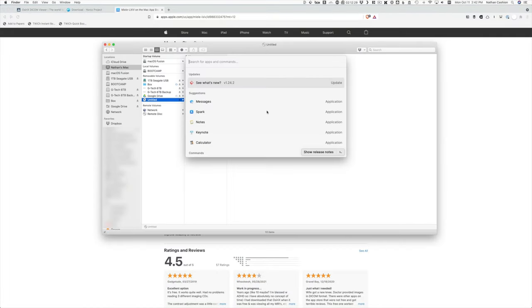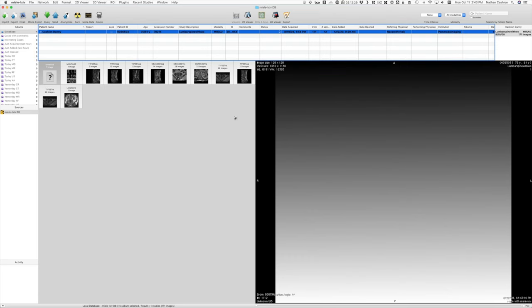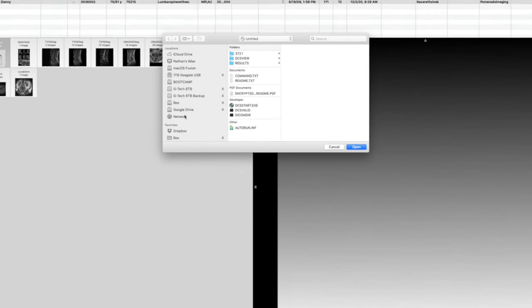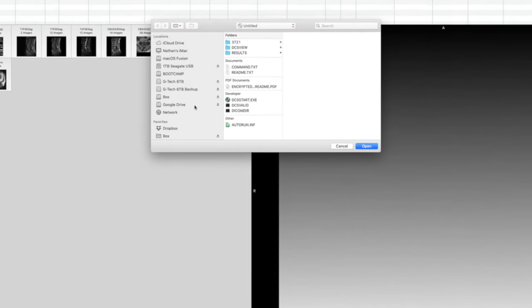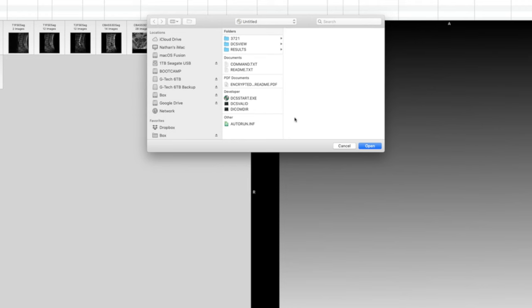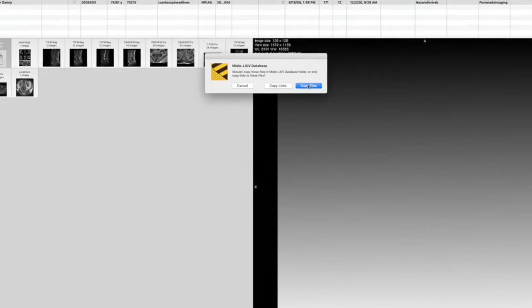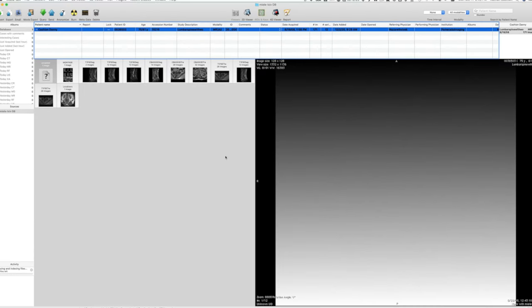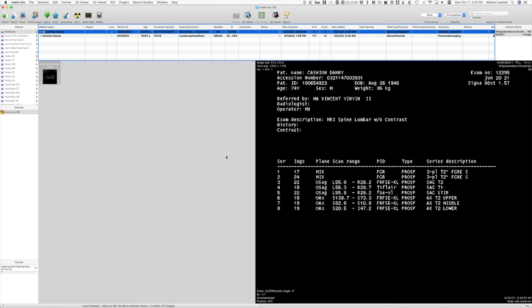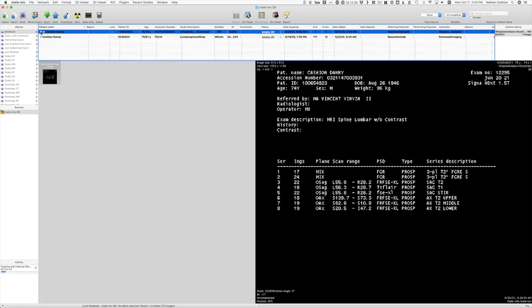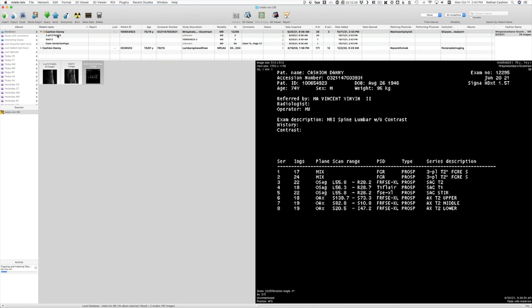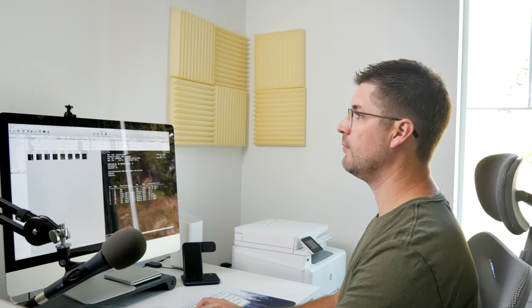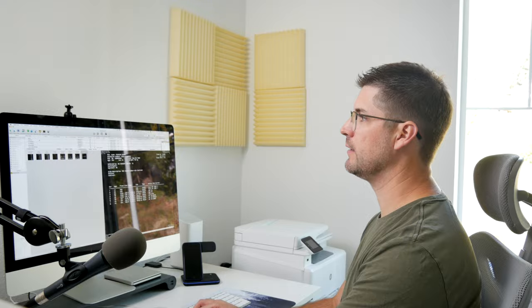So I'm just going to go ahead and I'm going to use Miel. So I'm going to open it up here and you'll see that I have a previous image, another MRI for my dad from almost 10 years ago. But what I want to do is I've already put the CD or the DVD into the drive and I just want to import and then I'm going to choose that disc. It's automatically going to open it up. I'm just going to say open and see what happens. I want to go ahead and copy the files into the database and we're just going to give it a minute to ingest these files. And there we go. It's pulled in the images from this disc and you can see they're starting to populate one by one. So it does take just a little bit to download all of the files from this disc. All right, there we have it. It's imported into my database.